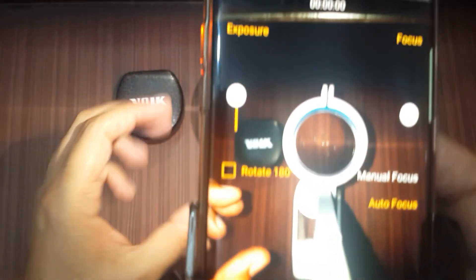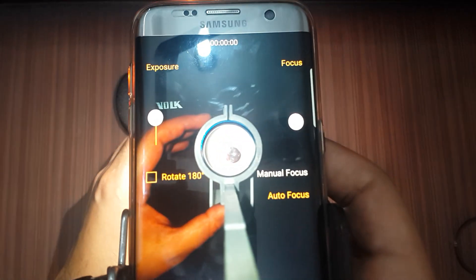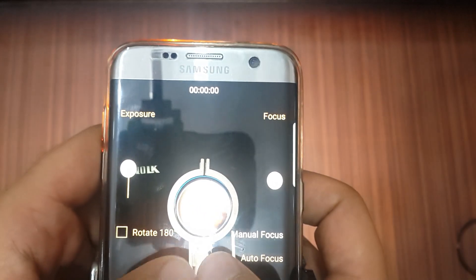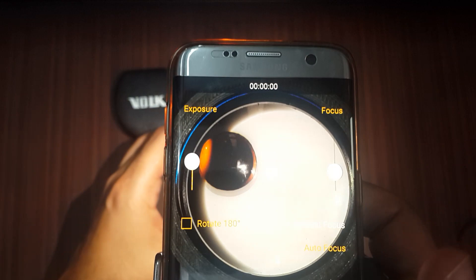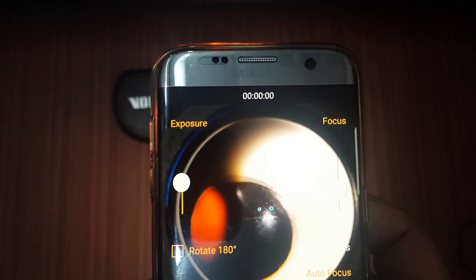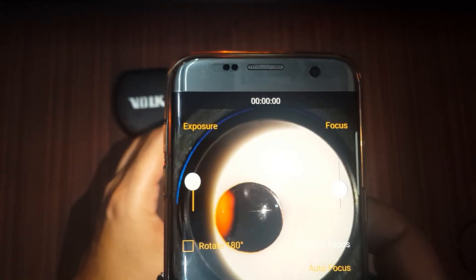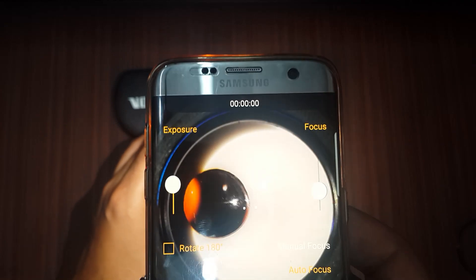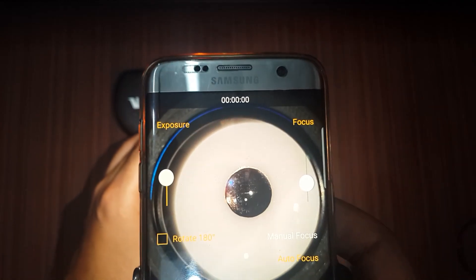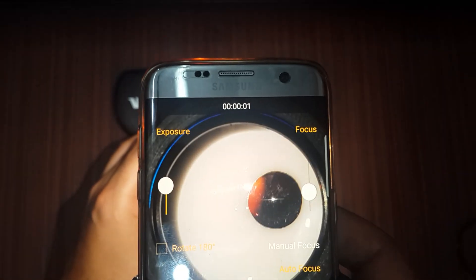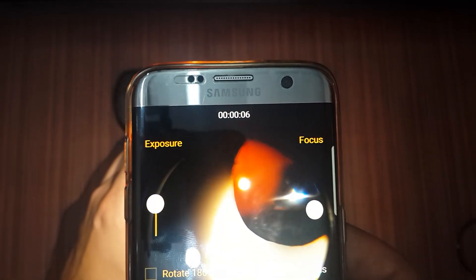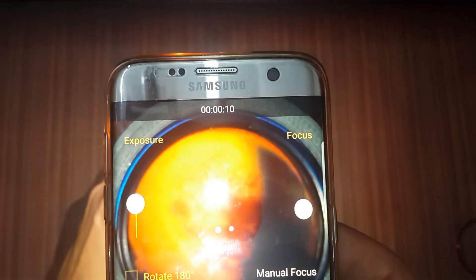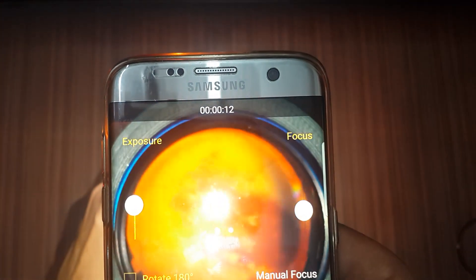Video mode captures video. I will zoom in. Start near the model eye or the pupil. If examining a patient, start capturing. Moving backward, you can see the red reflex.